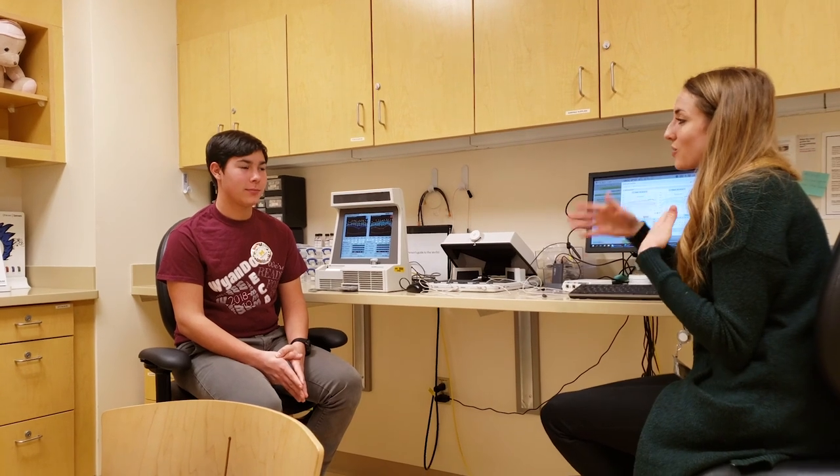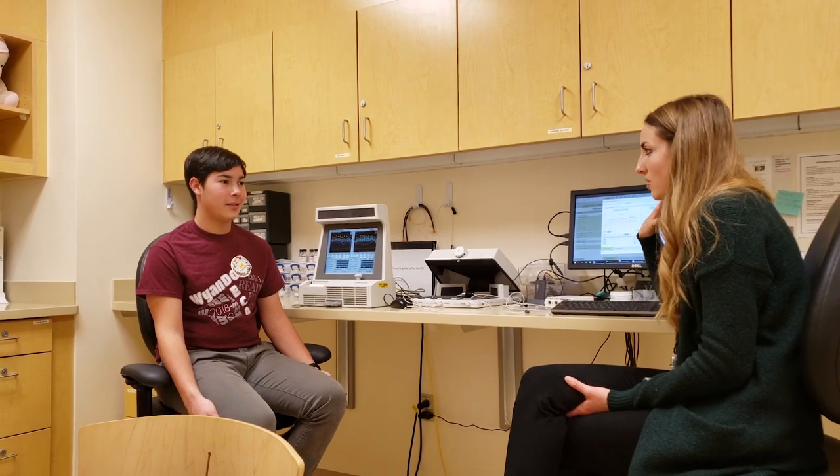I really like it. If we were to hear my own voice, it's very different — I can hear my lips a lot more. So I have to think about it a little bit more. Basically you're just constantly retraining your brain. Whatever you hear, that's what you're then going to want to repeat. So if you're noticing that difference now, that's good, because that means you can continue to work on that. Hopefully over the next few weeks that becomes more natural to you and then you start sounding a little bit better to you too.